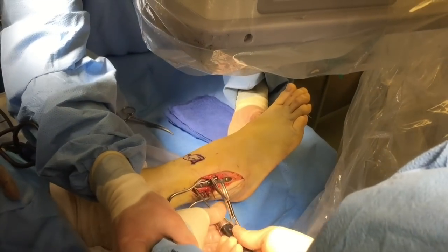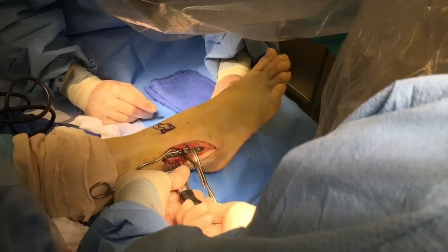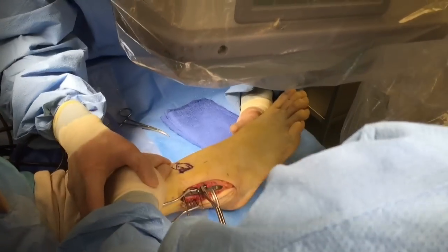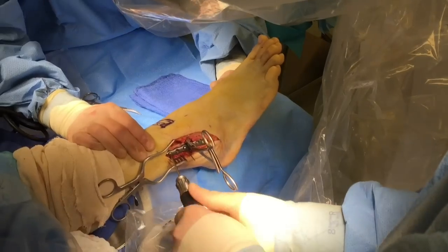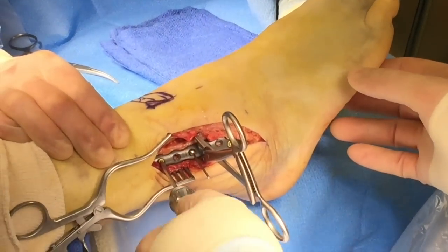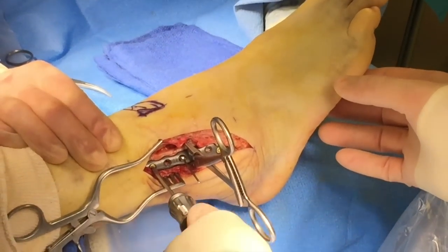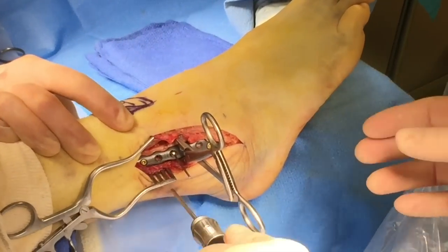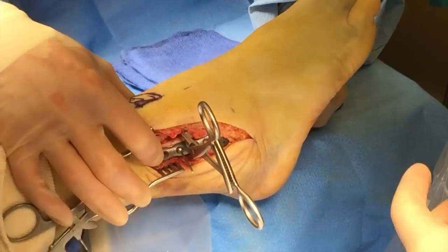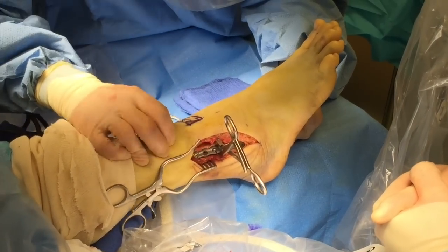Do you want to lock the second one? Fourteen locking screw next — there it is going in, and it's about as easy as that. We'll check on x-ray in a little bit. We're also getting a locking screw for the adjacent hole. That's why this set is so easy to put together, and again, they're very low profile so it won't be raised up and hitting the skin.